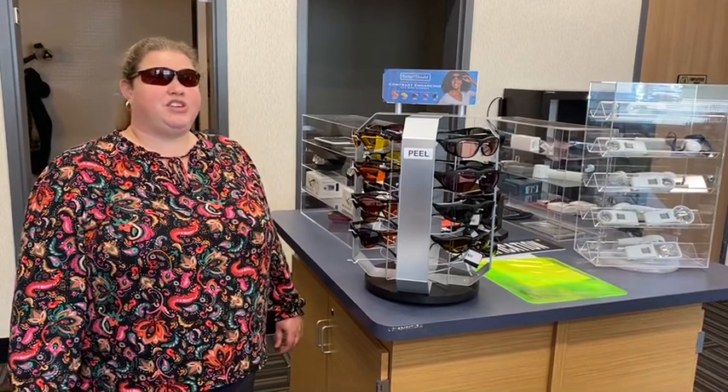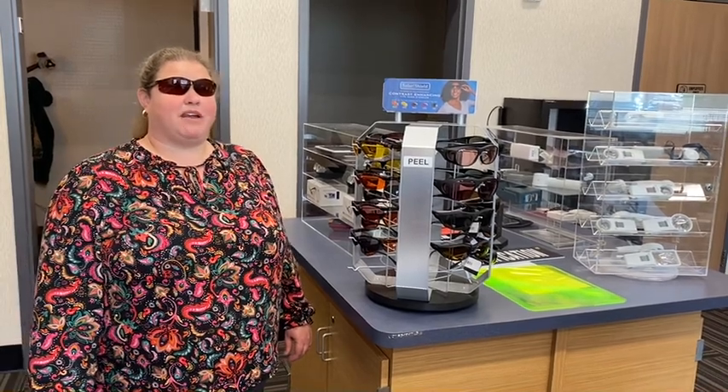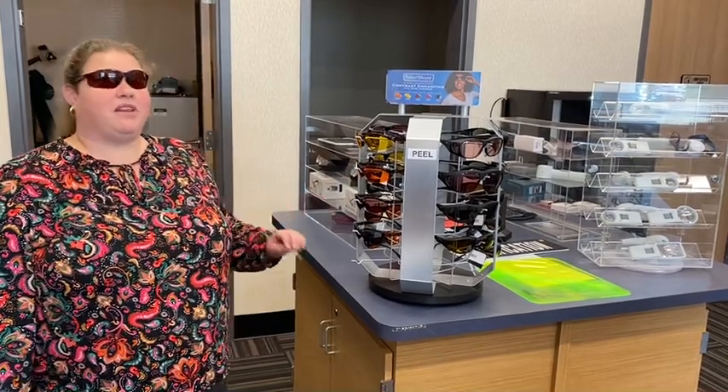These shields come in mainly a few different colors. You have gray, you have amber like mine, you have orange, yellow, and there are some other colors — but right now that's primarily what we have.